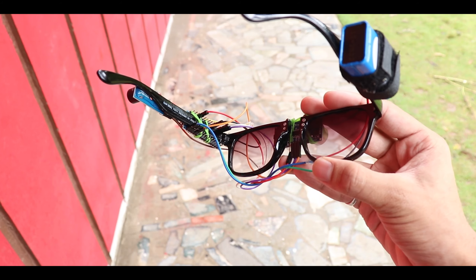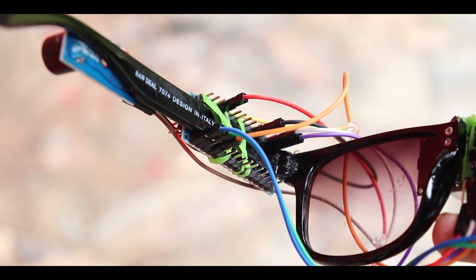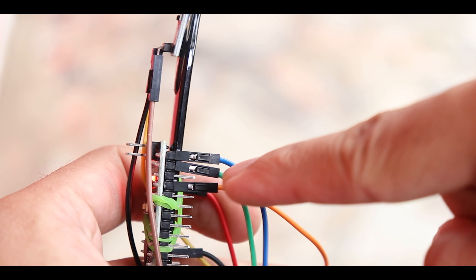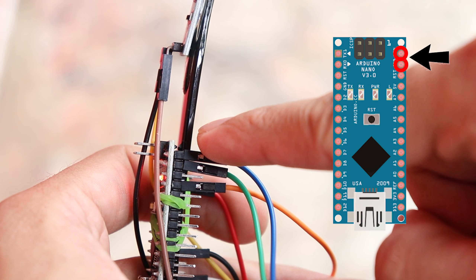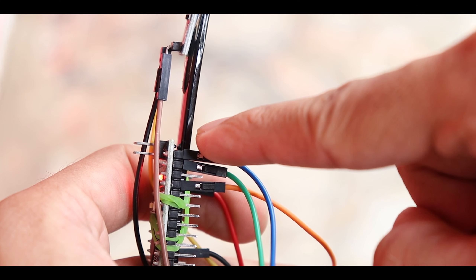Now take your battery connector and two jumper cables. Divide the jumper cables in half and expose the wires, then connect them with the battery connector as shown.